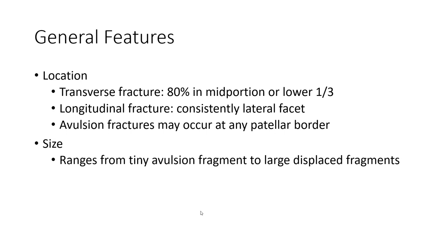According to location, transverse fracture accounts for around 80%, in the mid portion or lower one third. Longitudinal fracture is consistently in the lateral facet. Avulsion fracture may occur at any patellar border. Size ranges from a tiny avulsion fragment to a large displaced fragment.